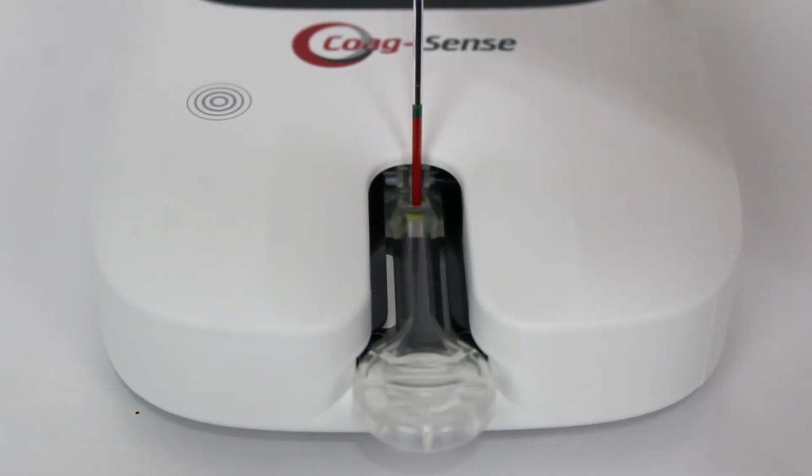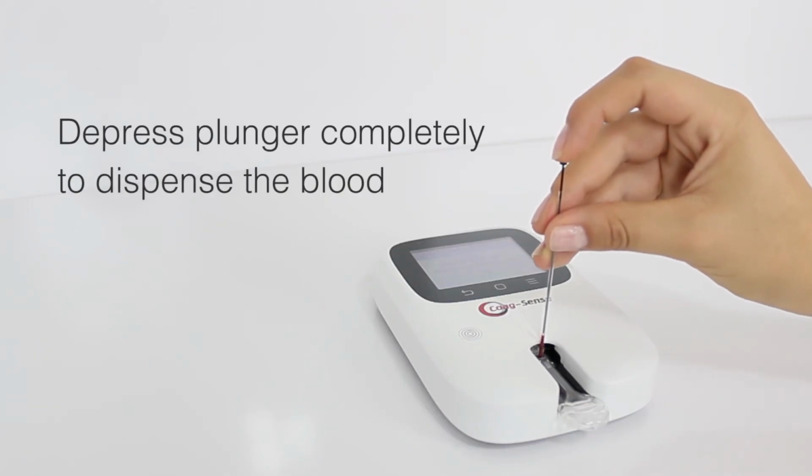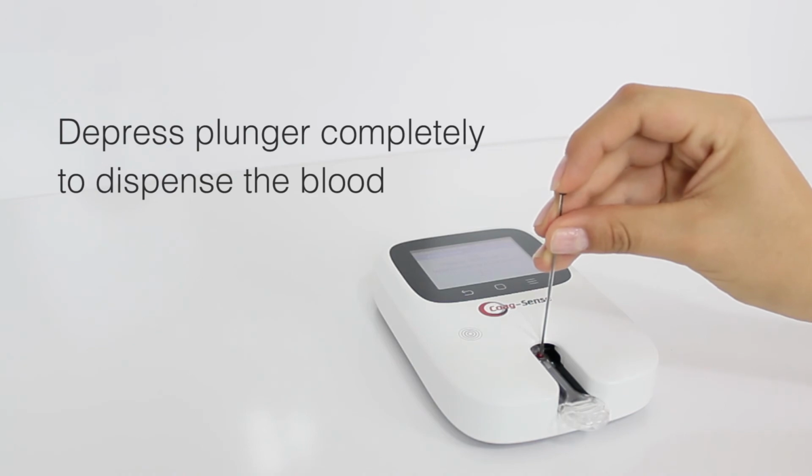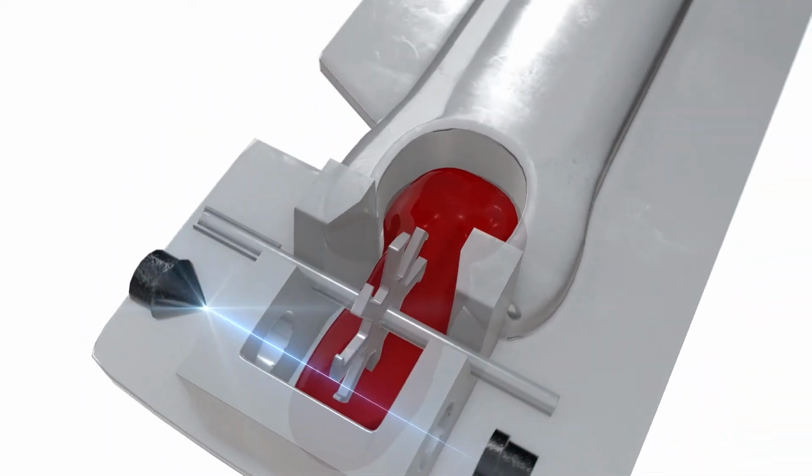Insert the transfer tube tip into the sample application well of the test strip and touch the tip down at the flashing green light in front of the spinning wheel. Depress the plunger completely to dispense the blood. The light should go out and the meter should display "Testing, please wait."